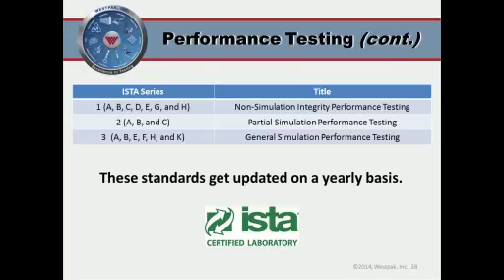We're often asked which standards should be used. We have heard, and you have probably heard as well, that standards such as ASTM D7386 or D4169 tend to be favored by folks at the FDA, for example, primarily because they are consensus standards. What does that mean? It means there's a bunch of people sitting around the table, and these people are balanced in terms of their interest, whether they're interested in the production of equipment for it, whether they're interested in the standards itself, or they have a general interest. And that balanced group of people then have to agree on the standard.